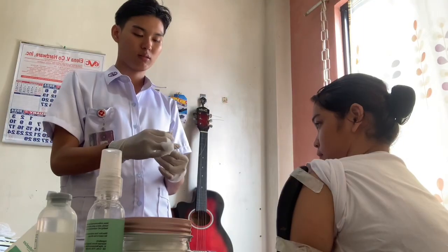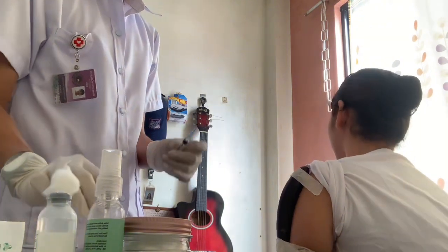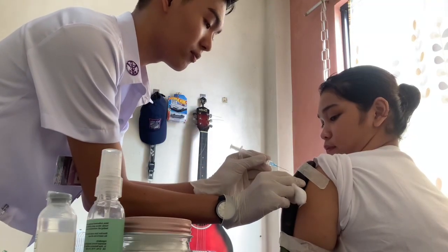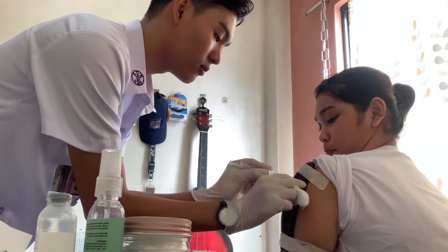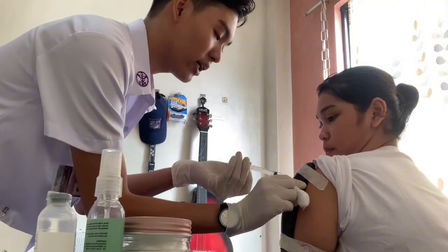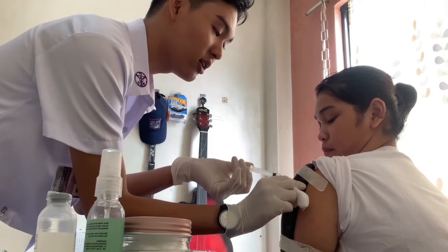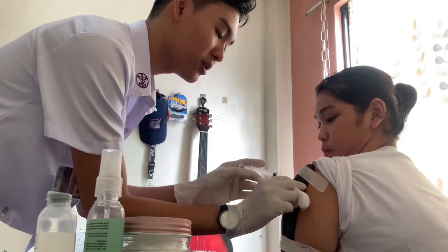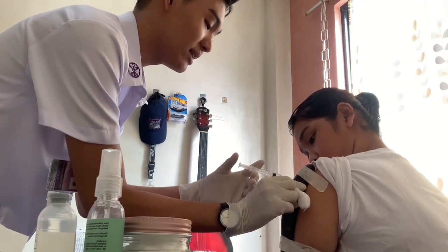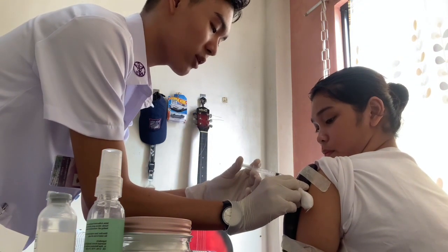So after that, pinch. Now, do not inject the medication quickly. You have to aspirate the needle for 5 to 10 seconds. If blood occurs, you can remove the syringe, dispose, and take a new medication. If blood does not occur, then you can just continue the medication. And since no blood has occurred, I will just continue the medication. Slowly, with even pressure.